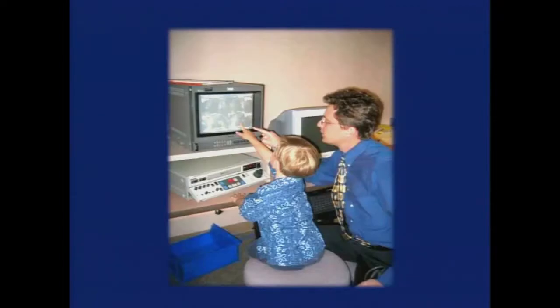Now, by way of introduction, I show you this picture. This is a picture of my little boy and I a number of years ago looking at a stress echocardiogram. You see, my son is pointing out to me where he thinks he sees a wall motion abnormality, and I'm trying to explain to him that the study is in fact normal. I think this highlights one of the limitations in echocardiography, and that is that the determination of global and, to a larger extent, regional function is subjective and dependent upon expert visual analysis. So at the end of the day, the report is likely going to reflect my interpretation of this study, as there's a perception in some places at least that I'm a more experienced echocardiographer than my little boy.